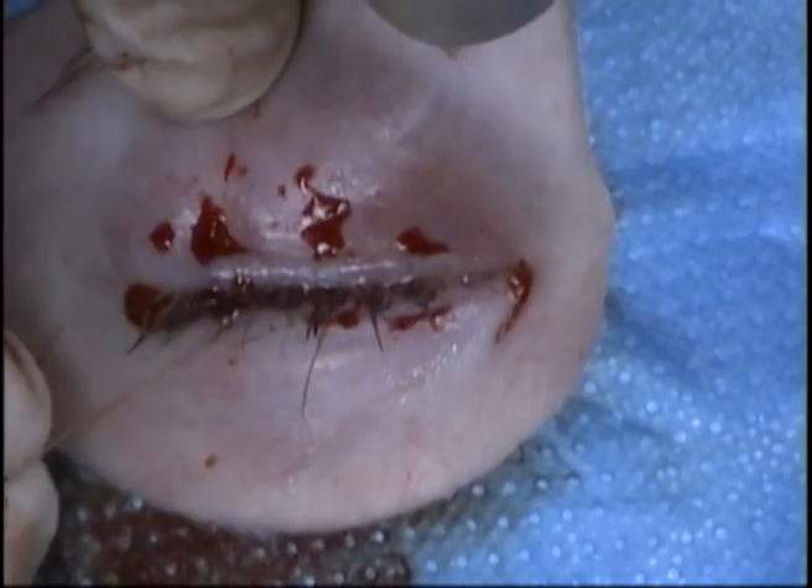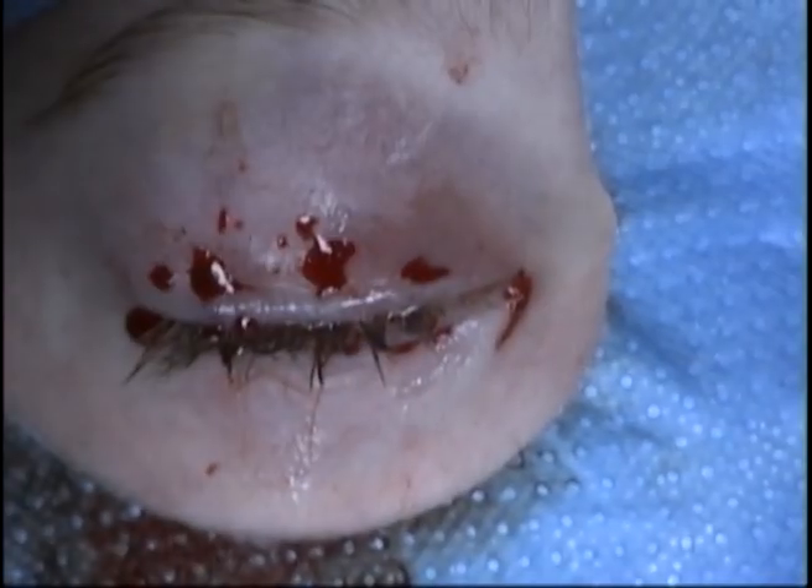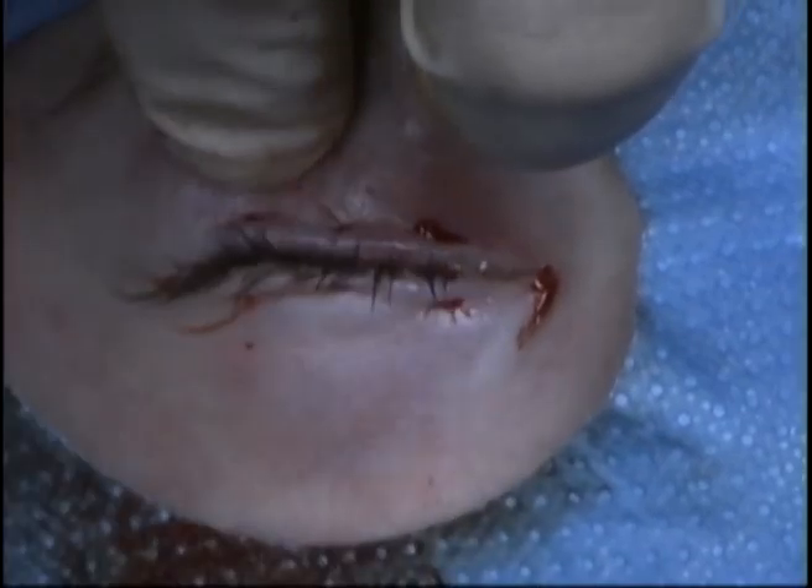At the end of the case, an eye pad is placed and the patient will return in approximately one week.